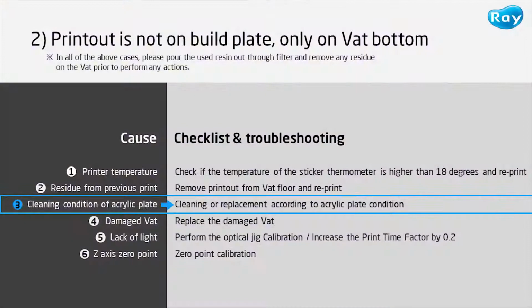And when you wash it, please note that the acrylic plate absolutely has to be cleaned with water only. If not, the surface will turn blurry and not be usable anymore. Highly contaminated acrylic plates may cause distortion on printouts.